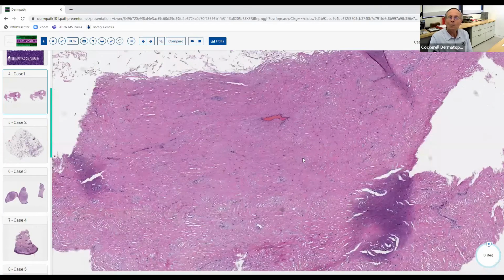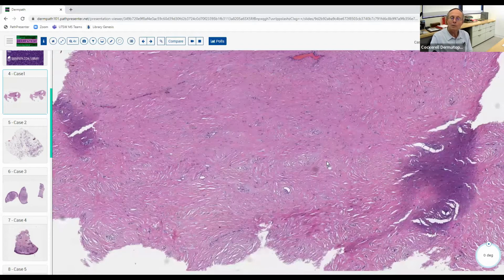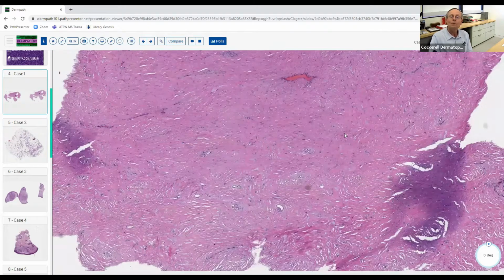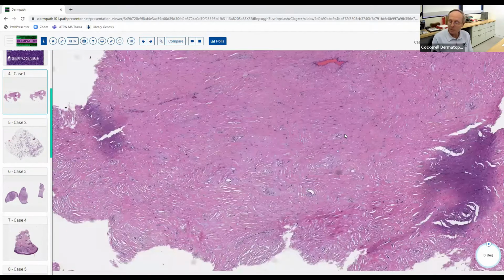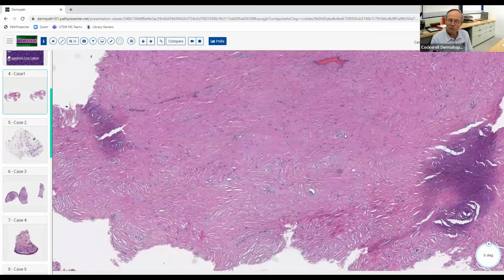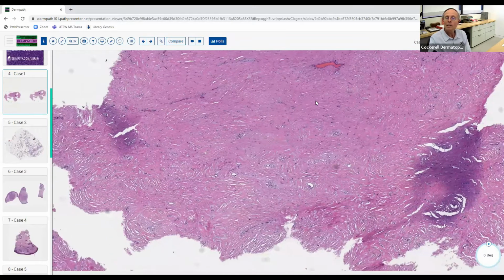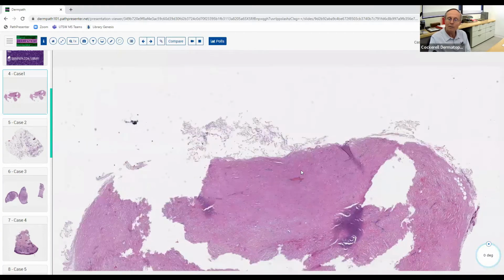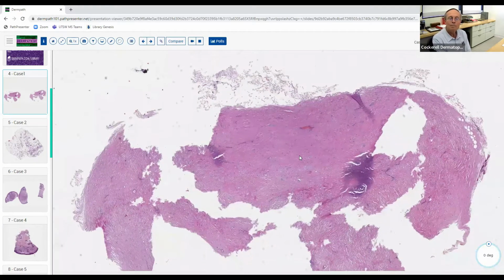So the way we usually do these is just ask if anybody wants to volunteer and discuss what they see, and go through whether you think it's an inflammatory process or a neoplastic process, benign or malignant based on what we see, what kind of differentiation it's exhibiting. If it's inflammatory, which of the 9 patterns of inflammatory diseases it generally tends to be recapitulating, and then which specific diagnosis. So somebody want to give this a go?